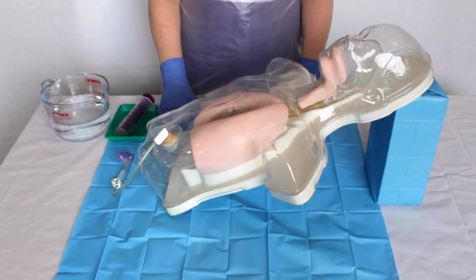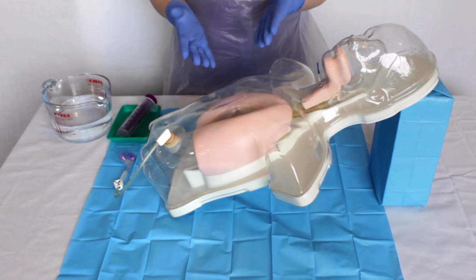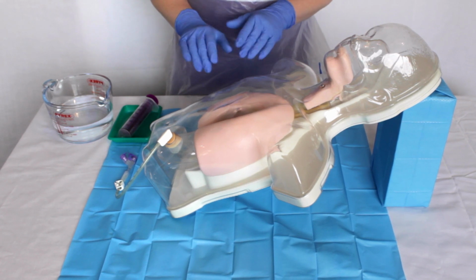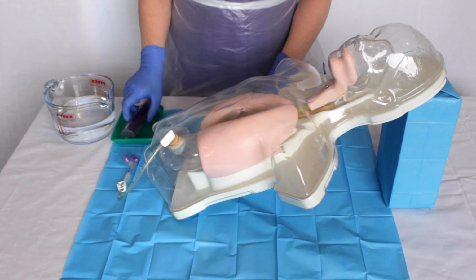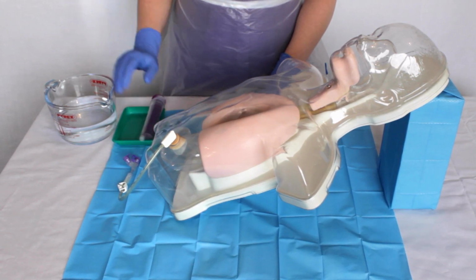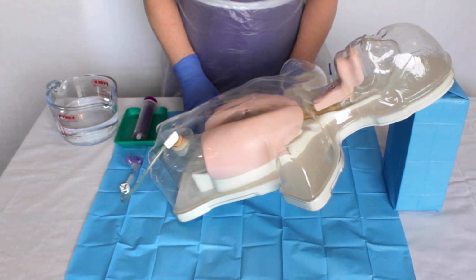Before and after handling the tube, wash your hands with liquid soap and water and dry them thoroughly. Apply gloves. You will need a 60 ml enteral feeding syringe and some water, the type and volume as advised by the managing healthcare professional.